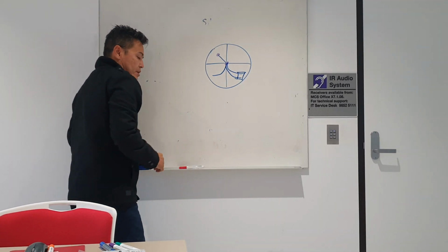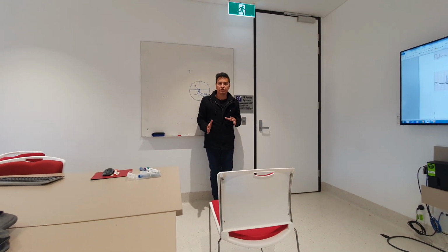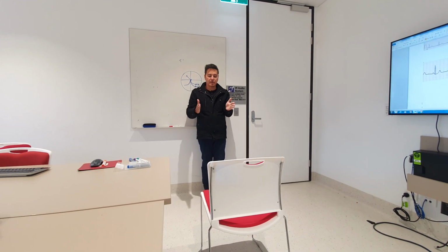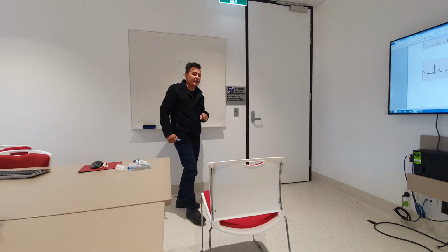So I want to explain something. Okay. So let's say that this is the heart, right? And those 3 leads that I put on you, right, is looking at an angle of the heart like this, okay? So that's kind of like your selfie angle, okay? The selfie angle is called lead 2, and I'll talk about that in a moment.